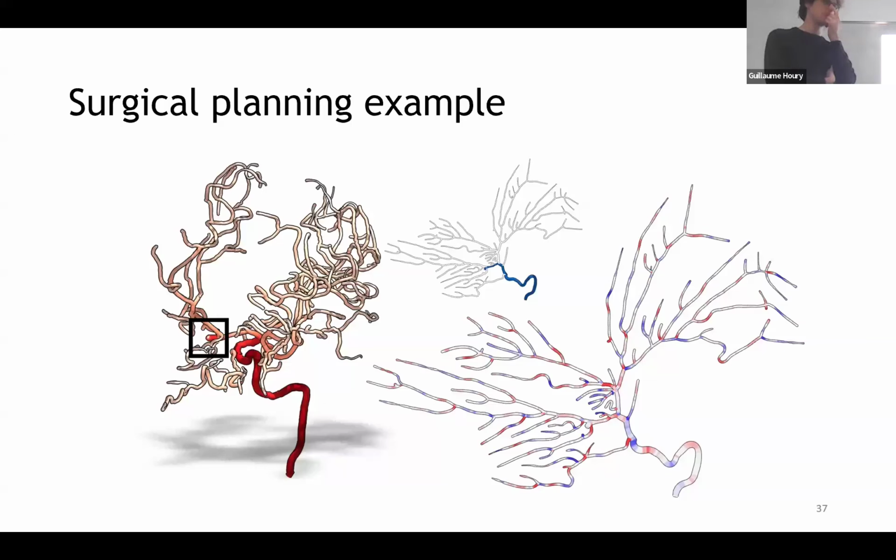Then they do the visualization like this, and then they choose the catheter, and they follow it by imaging. Yes, exactly. The whole game in those kinds of interventional techniques is that usually you have a 3D scan, but you cannot operate with real-time 3D. So usually you have 3D, and in real time you have a 2D view, and you have to imagine in your head how it works.